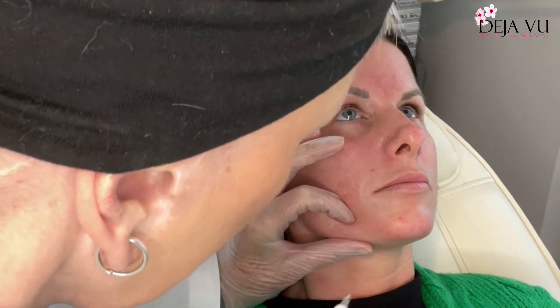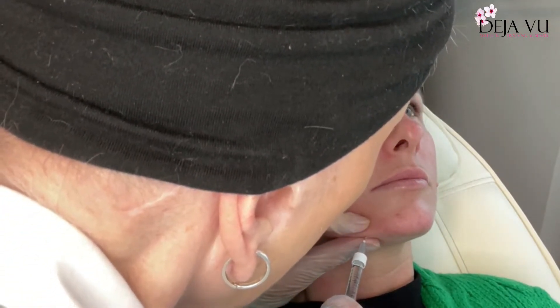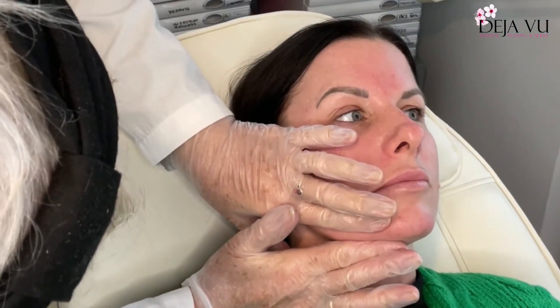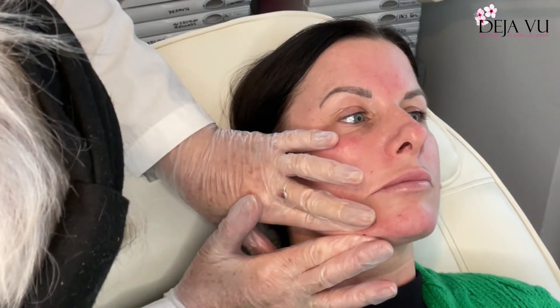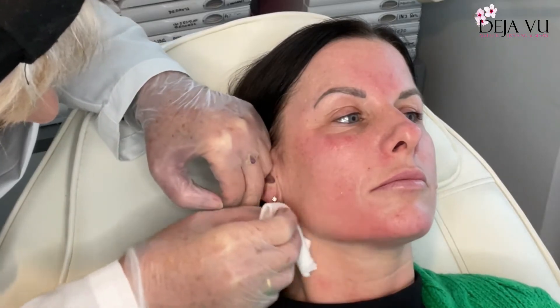That's two. I just need to get another syringe, and four. Just squeeze this to make it nice and sharp. Now you can see that's a really nice strong jawline there, nice and sharp.